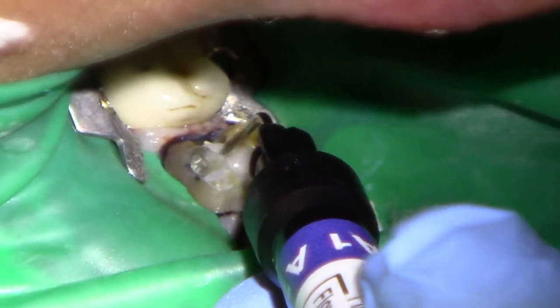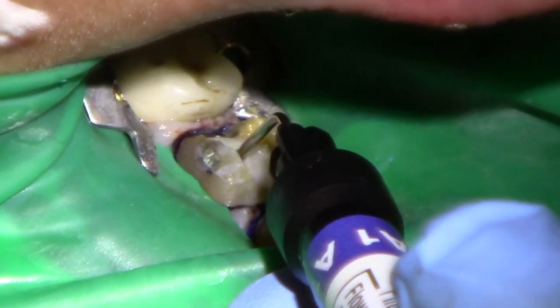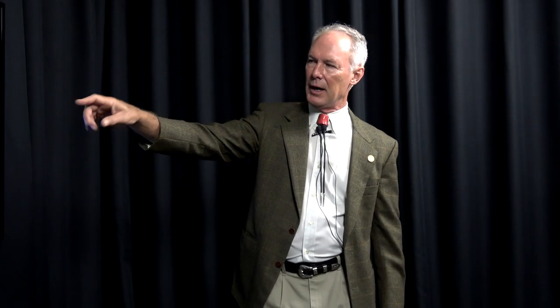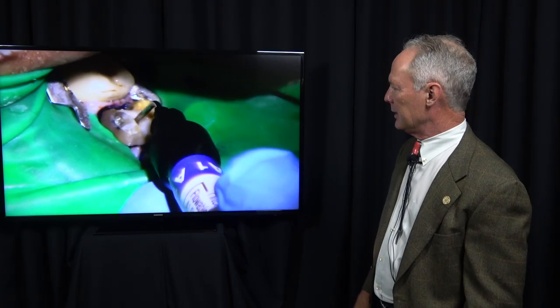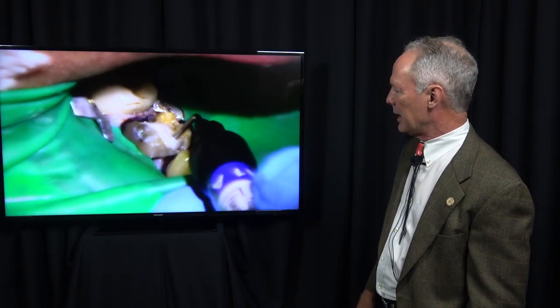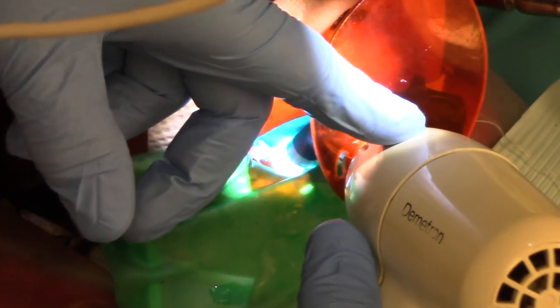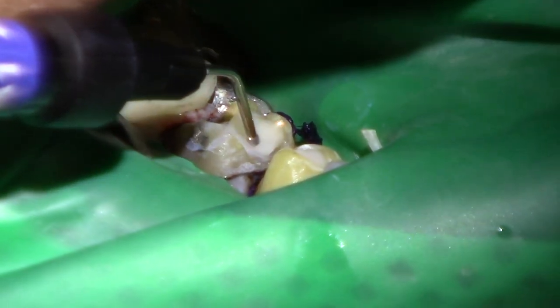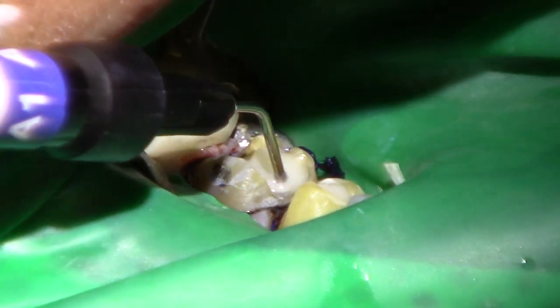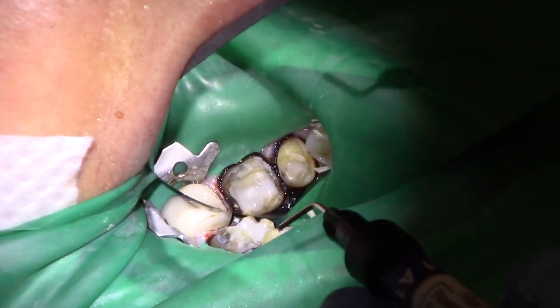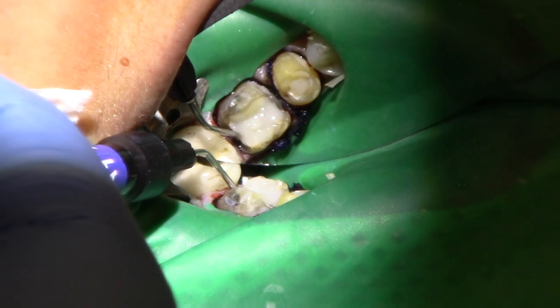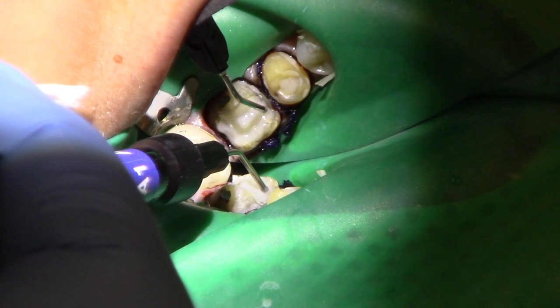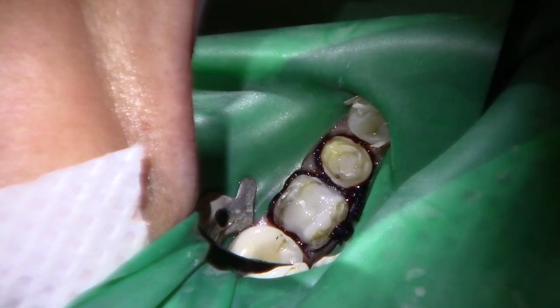This is a flowable composite, and I'm going to place it in layers. Be sure you keep the tip of the syringe in the flowable composite so you don't trap air bubbles. Each layer is going to be about a millimeter to a millimeter and a half, and then I'm going to cure that and continue to fill. See how the tip remains in the filled resin. Got excellent hemorrhage control from the hemostatic agent and the cord and the 38% phosphoric acid.